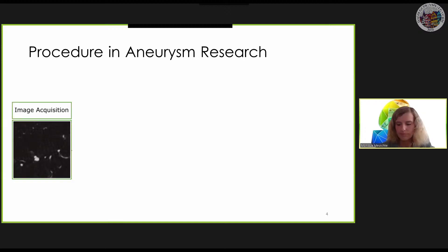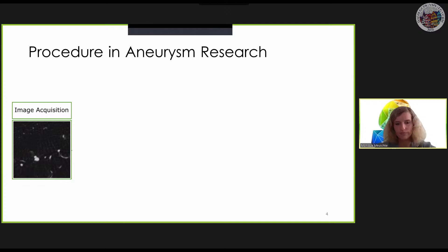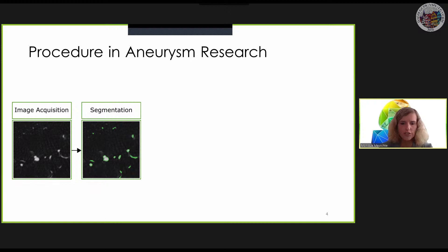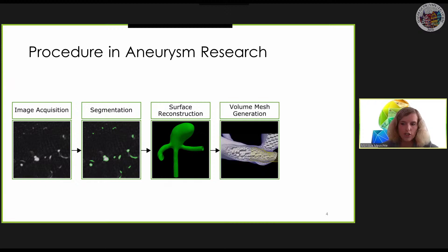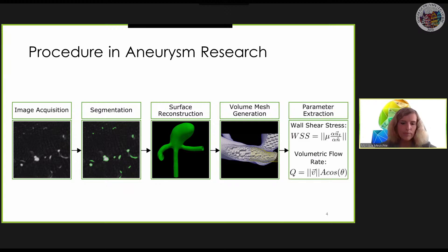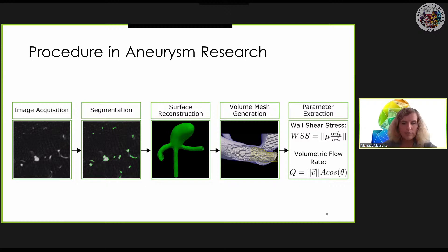The basis for simulation are clinical images with high vascular contrast. In these images, the vascular area containing the aneurysm is segmented and then a surface mesh is reconstructed. The interior of the surface mesh is then transformed into a volume, which serves as input for the blood flow simulation. The blood flow simulations result in complex data consisting of time-dependent scalar, vector and tensile fields that describe the blood flow and mechanical wall behavior over the time of a heartbeat.